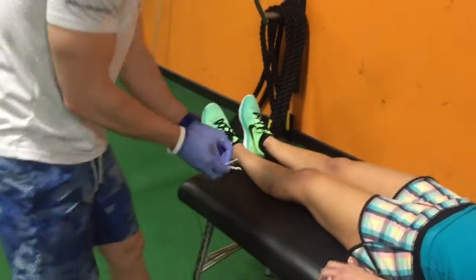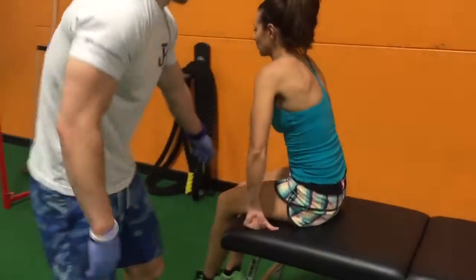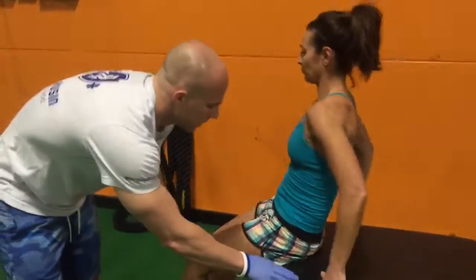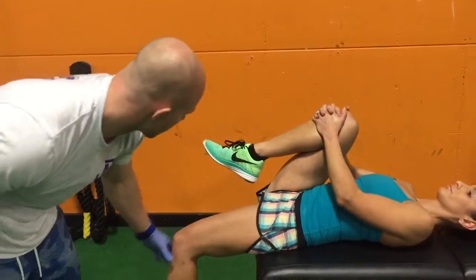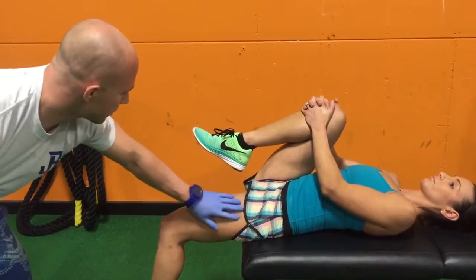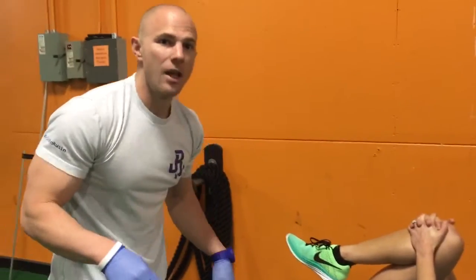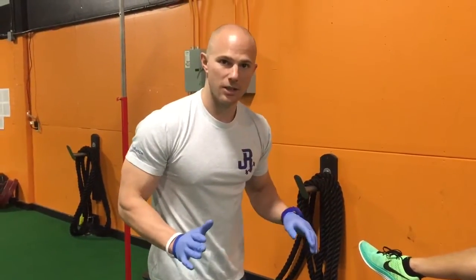Come back up and get into the Thomas test position — sacrum here. Bring your right leg up to your chest, come a little bit more towards me, and let the leg relax. You can see the angle change here from just the musculature that we worked on. And just to be clear, we're not breaking up scar tissue — this is a neurological phenomenon of musculature reducing its tone.